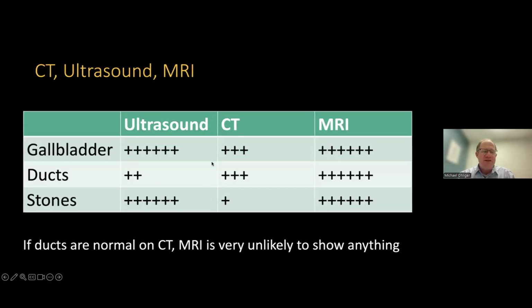So one thing I'll talk about is what it's good for, and here ideally we would have images, and I think in a future version we will. But I do want to briefly talk about ultrasound, CT, and MRI, because ultrasound and CT are obviously really good modalities. And to be honest, if someone comes into the emergency room with abdominal pain, or if you're working someone up with an initial acquisition, you're going to start with ultrasound or CT. You're not usually going to start with an MRI. And so it's good to think about what they're good for.